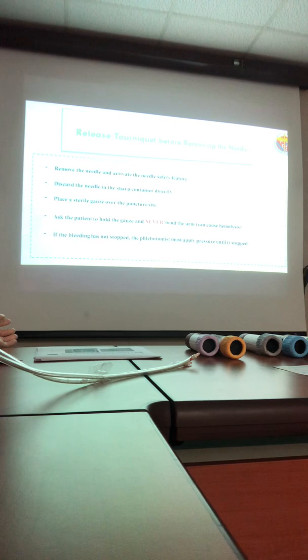If the bleeding has not stopped, or the patient is under anticoagulant therapy or something like this, the phlebotomist must apply pressure until the blood stops.